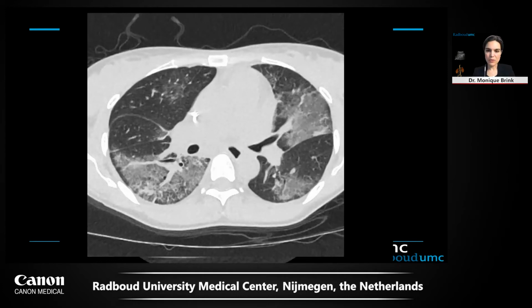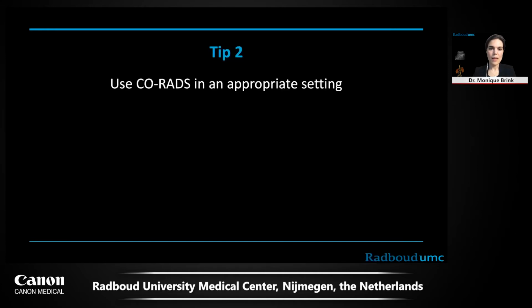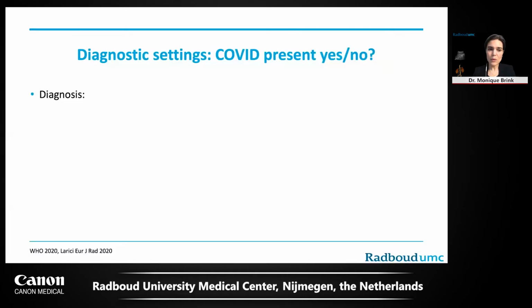And if we would have used CT in appropriate setting, we might have prevented this false negative CT, and I'm going to explain you why. That's my second tip. Use CT or CO-RADS in an appropriate setting. And what is an appropriate setting? Well, actually, if you would like to make a diagnosis, so whether or not a disease is present, you actually have 3 situations in COVID-19.